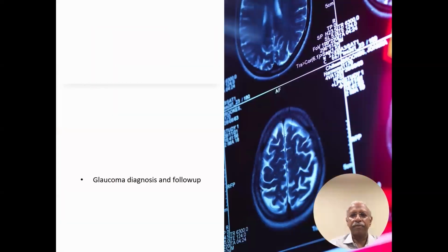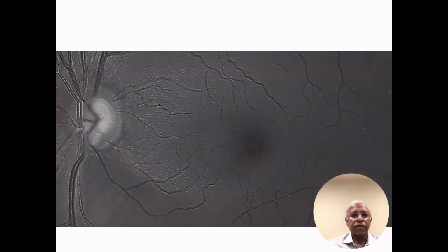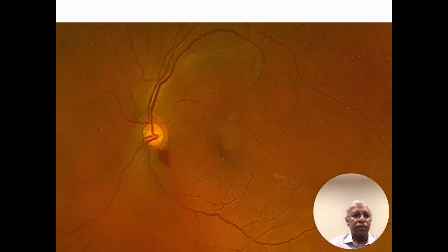And glaucoma diagnosis and follow-up is invaluable to us, very, very easy to catch. We can see here the RNFL is smoothened out, while superiorly it is quite normal. When you do a red-free, you can see the complete ironing out of the RNFL here. We can catch that quite early. We can explain to the patient conditions such as these, where there's a splinter hemorrhage, a condition that is seen in early glaucoma, and why this person needs further evaluation, further follow-up, and long-term treatment, easily explained to the patient.